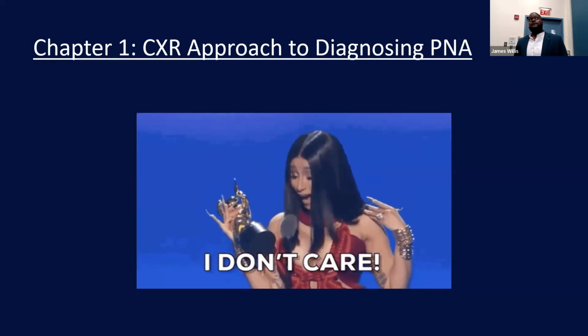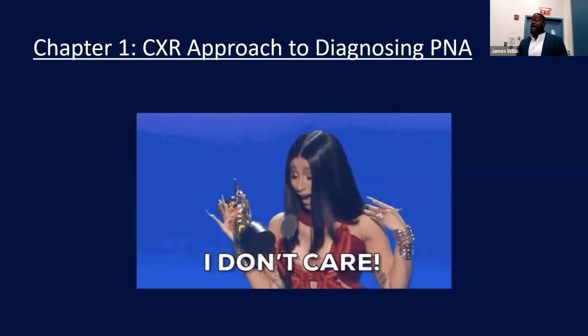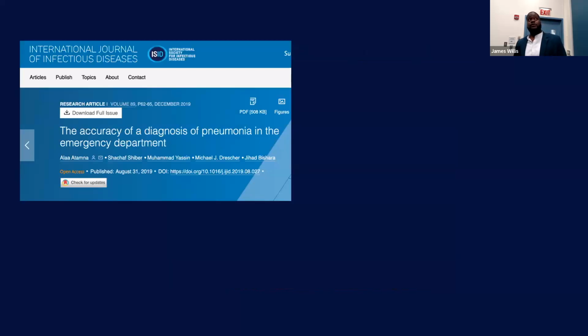But pretty much, it's really important for us to use all different modalities in diagnosing pneumonia or different clinical diagnoses in the ED. But the importance of this presentation and exactly why I wanted to go over this, there's a 2019 article from the International Journal of Infectious Diseases that sought to determine the accuracy of diagnosis of pneumonia in the ED.